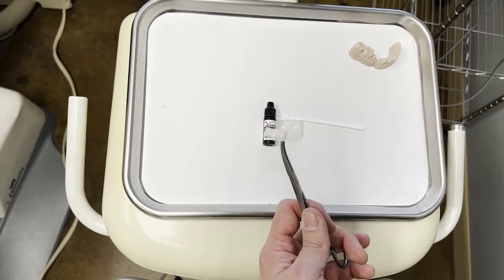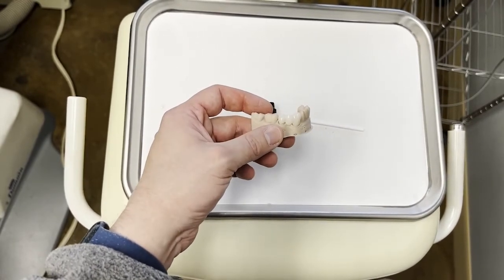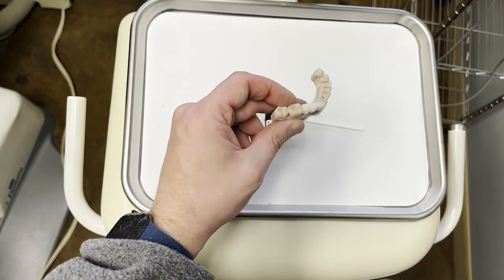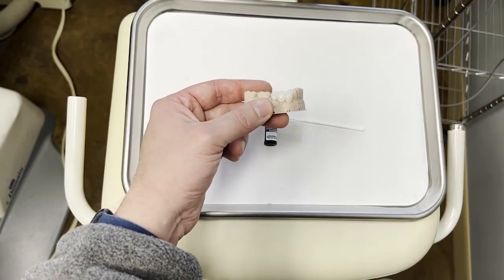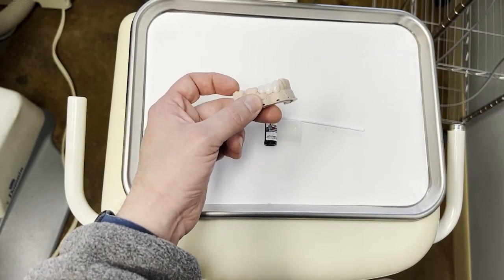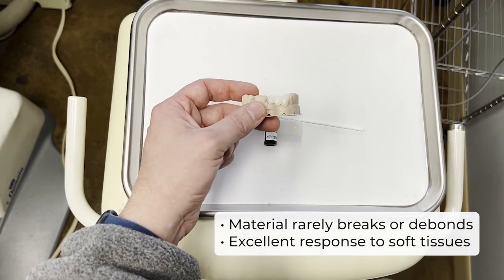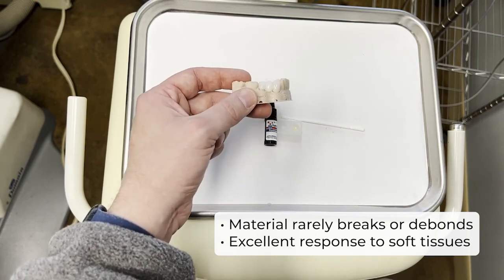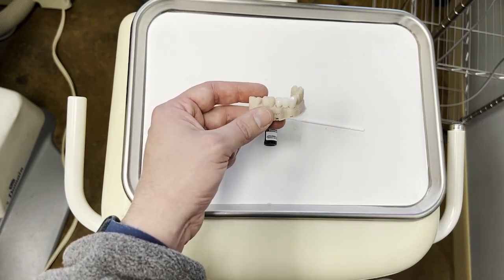So here's our glazed finished provisional. And now we're ready to try it in. So as you can see here, we have a really beautiful provisional that looks great. Look how highly polished it is and shiny from the glaze. Looks good all the way around. We have good close interproximal contact, so we're not going to get any mesial drift because we took that short amount of time it took to mark those contacts. It's going to make our life way easier. And with really just a few minutes of spending some time on anatomy, doing a good polish, doing a good glaze, we get a really beautiful provisional here. But one thing I always like to say is it all starts with the matrix. So the better matrix you're starting with, the better provisional you're going to get. And when we use a beautiful, strong material like Tuftemp, you're going to have no problems with this provisional breaking or coming out. This is going to be a great provisional restoration for the patient that will hold up well and give you great success when it comes to the day to try in our final restoration. Thank you.